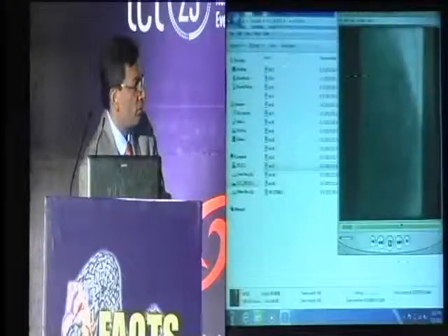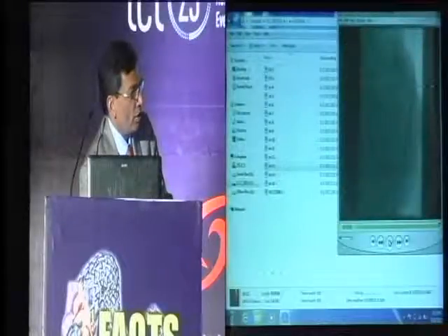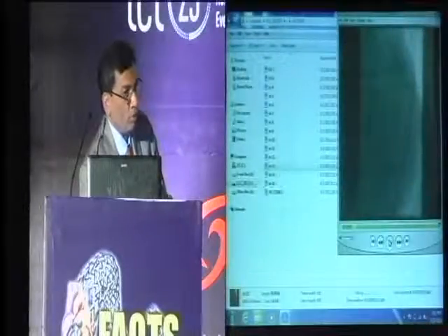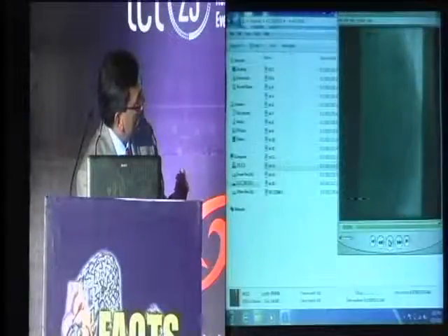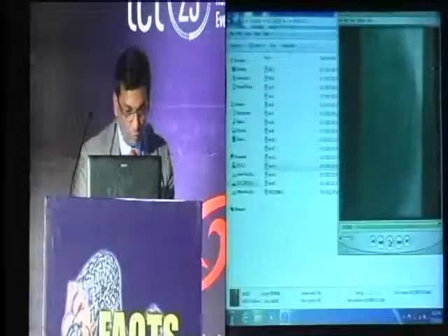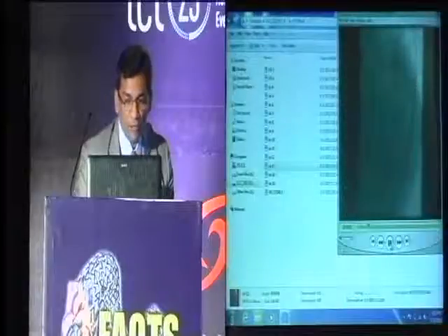Here's a demonstration of that. The balloon is up in the LAD, and the stent in the diagonal is not deployed. We then use the balloon as the marker to pull the stent as close to the ostium as possible off the diagonal.